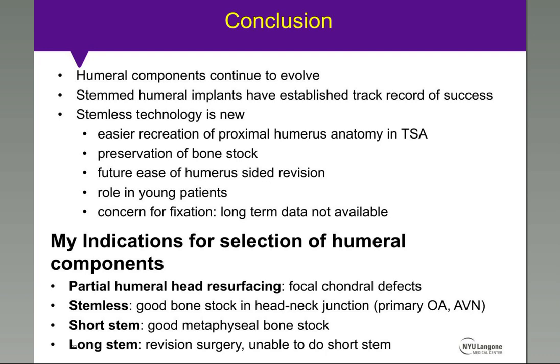I use short stems for the majority of my patients who have good metaphyseal bone stock, and I reserve long stem only in cases where I cannot do a short stem, or if I'm doing a revision surgery from a stemless to a short stem.